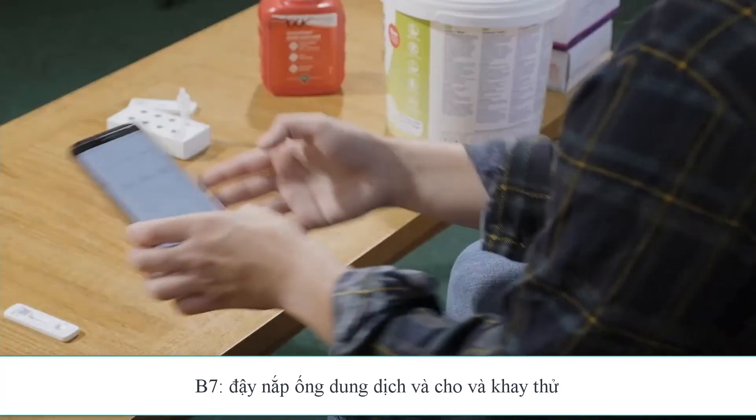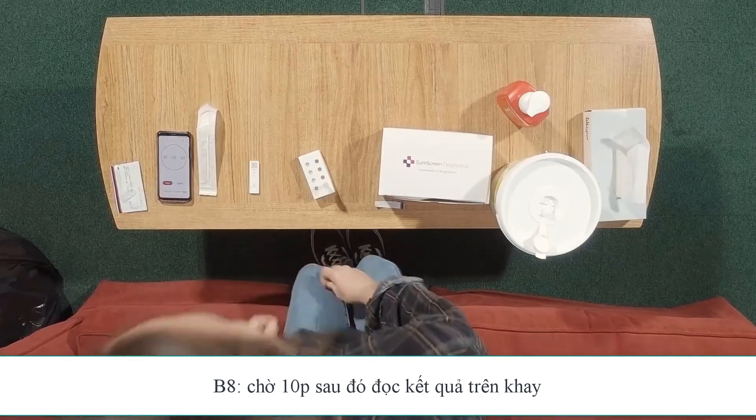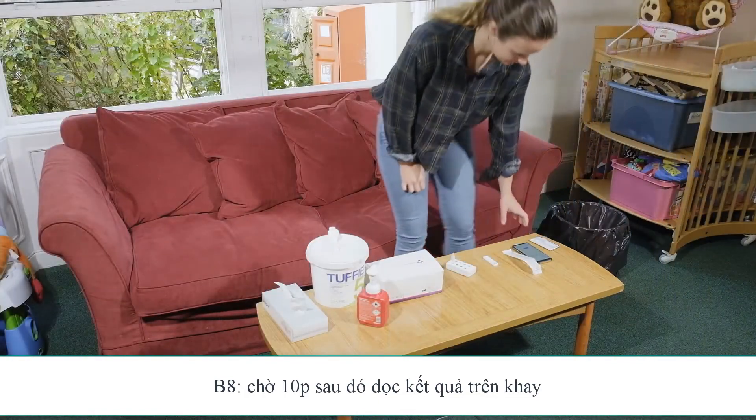Set your timer and leave this for 10 minutes for the test to be processed. Do not read the results before 10 minutes or after 15 minutes. After 10 minutes, you need to check your results.